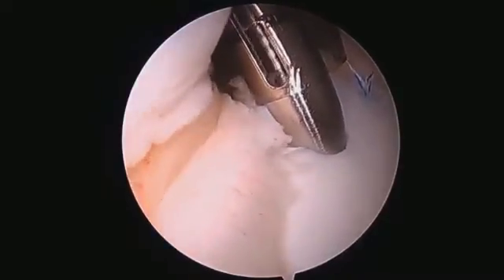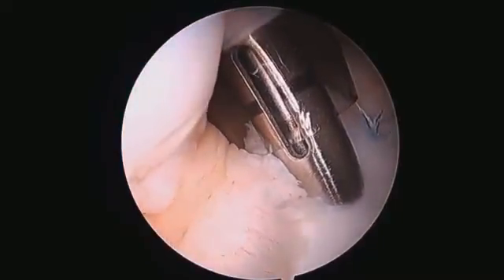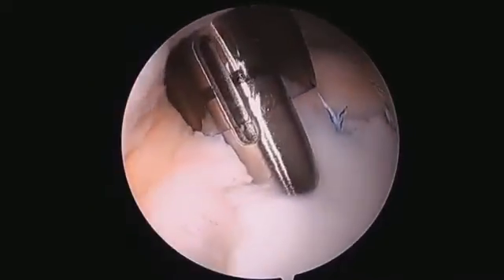It allows you to do little taps to get the anchor all the way down in. It will seat all the way back outside the shoulder, and in this case, it will seat all the way down. That's how you know you're down.